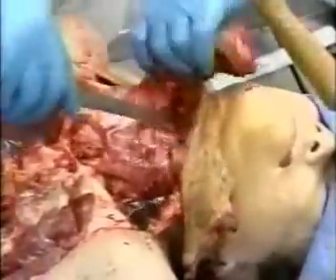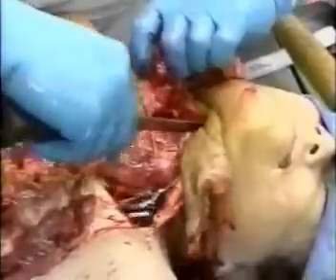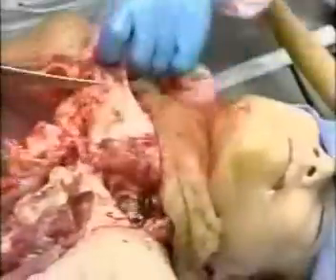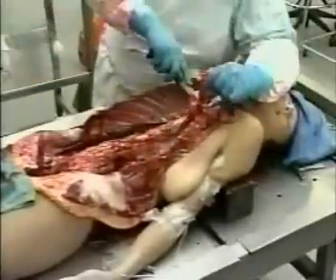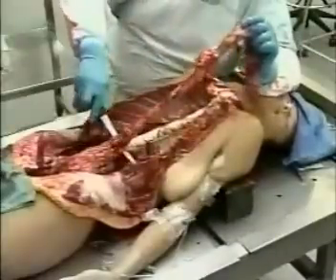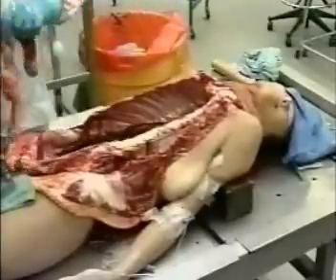He's going to free up all of the tissues through to the base of the tongue and then dissect down along either side so that the neck organs can be removed along with the tongue. Now that he's down in the upper chest, he can transect them, because that leaves enough room to infuse embalming fluid through those vessels.